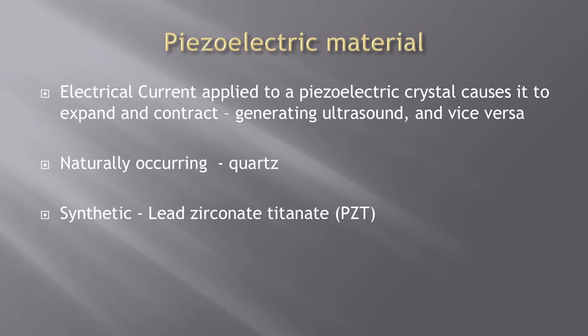So, when the military first started using this, they used naturally occurring quartz. Well, we don't have enough quartz in the world for all the ultrasound machines that are out there. So we now have a synthetic crystal, which we call the piezoelectric crystal. And that's what is at the end of the ultrasound transducer. And they do fracture, okay?